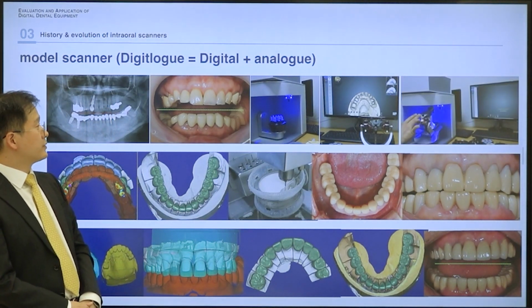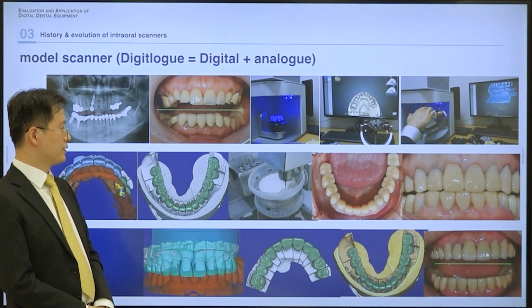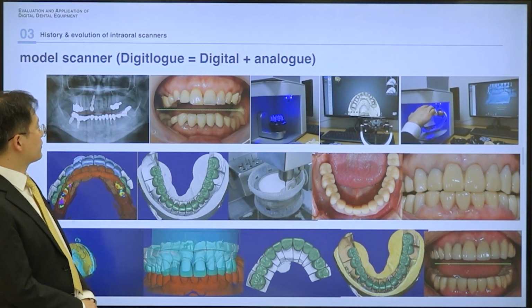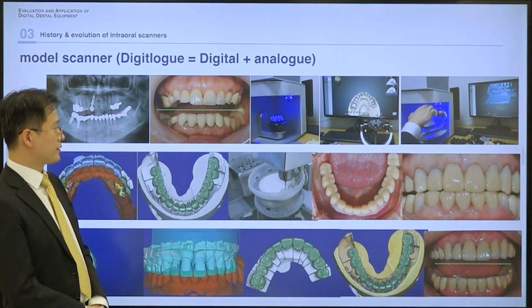And I will introduce the various technologies to complete the restorations. At first, I will show you how to merge conventional technology and digital technology together.